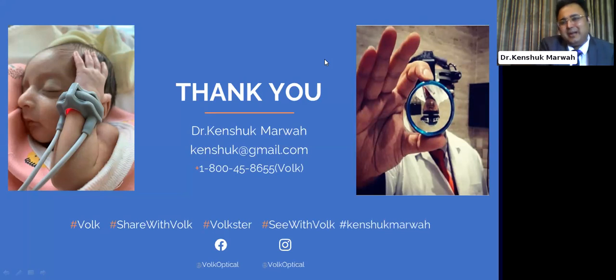The second mistake is that we unknowingly put it on the table and put a scratch on it. These small things go a long way. Keeping an eye on the minute things gives us a better picture. Same with the lenses: we have to be patient with them and take care of them like something valuable.